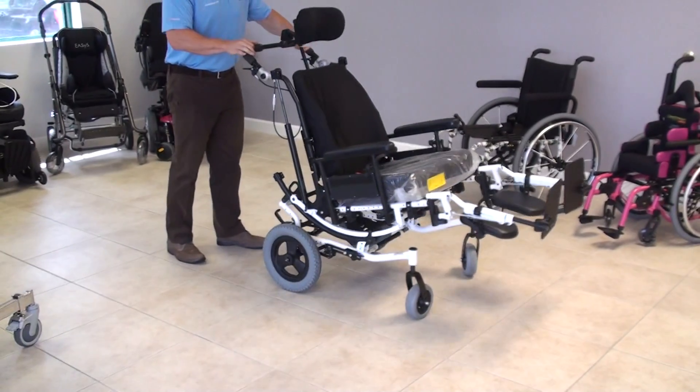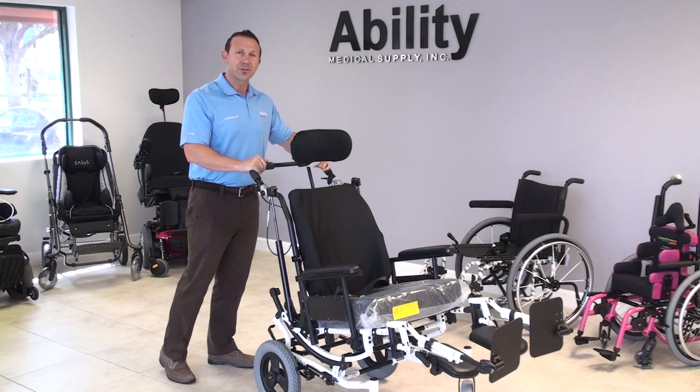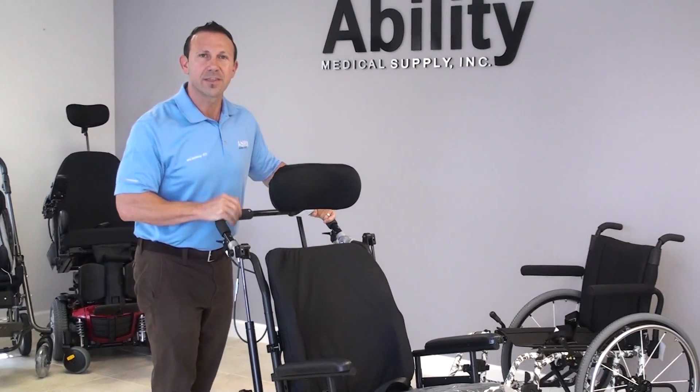And that's all I have for you today on the Solara 3G Third Generation Tilt-in-Space Manual Wheelchair. Thank you.